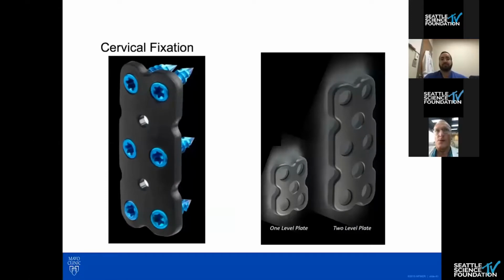There's also a potential for cervical fixation. This is the newest cervical plate that's come out. I've done one case with it, so not a terrible amount of experience. The manufacturing process, as I described, is quite high level and requires essentially laying down of the fibers. And the manufacturing process, unfortunately, has not caught up to be able to create any screws under, I believe, 4.5 millimeters. So titanium screws are still necessary to do these.